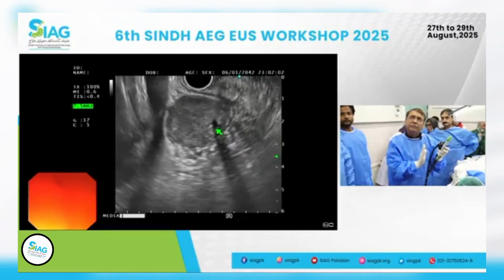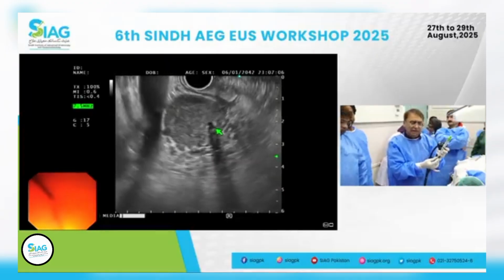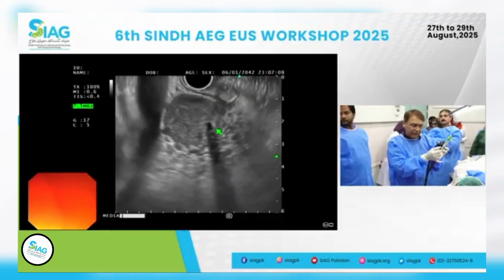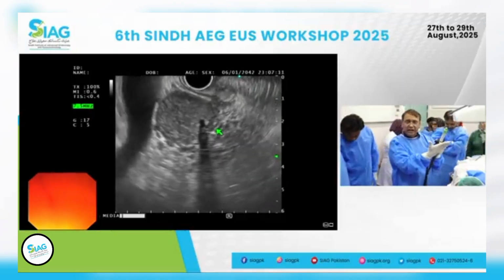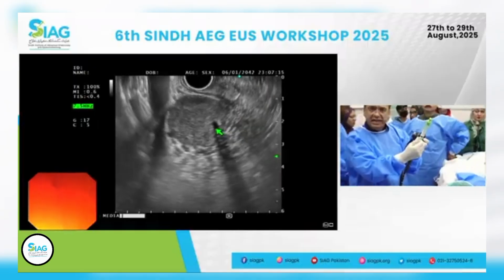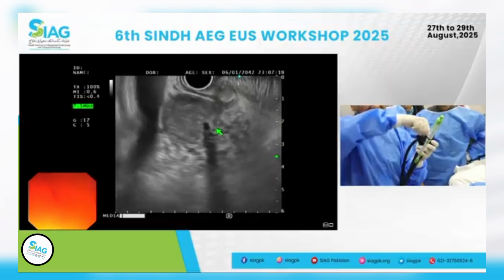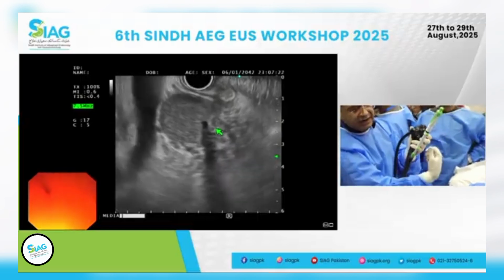One other thing, people don't understand the mechanics of the needle, especially the wheels itself. You see, those wheels are to the right of my hand, so I can easily unlock and lock those. Many times I've seen people struggling because it's on this side or it's on this side.